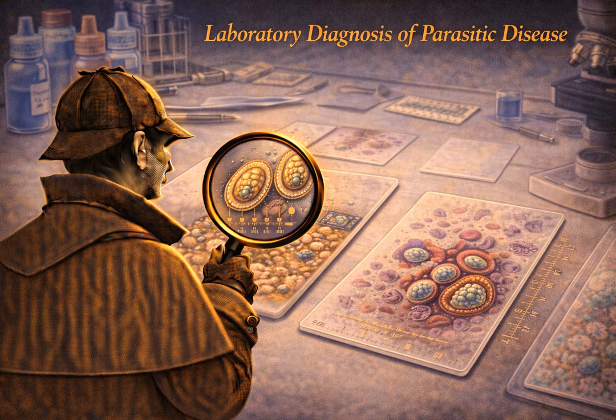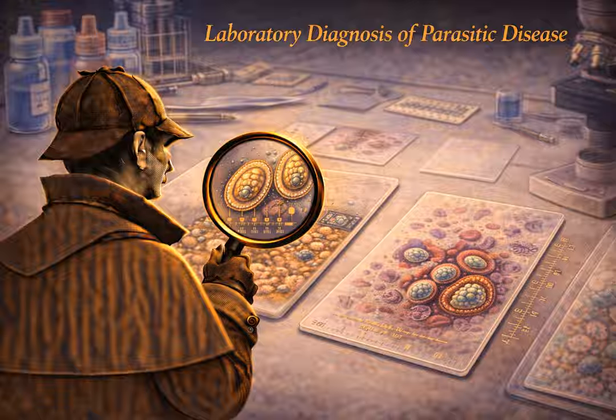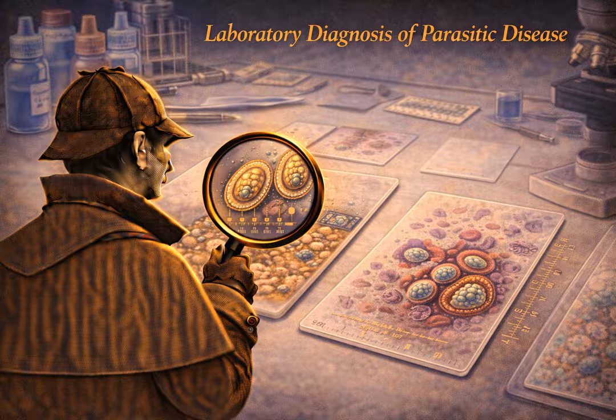And do they just take a standard tissue biopsy of that ulcer? They can, but the better microbiological technique is to scrape the margin of the ulcer, not the dead center, the active edge. You take that mucosal scrape, put it on a slide, and examine it immediately in a saline wet mount. You are hunting for those rapidly moving trophozoites containing the ingested red blood cells we talked about. Now, talk to me about the string test.